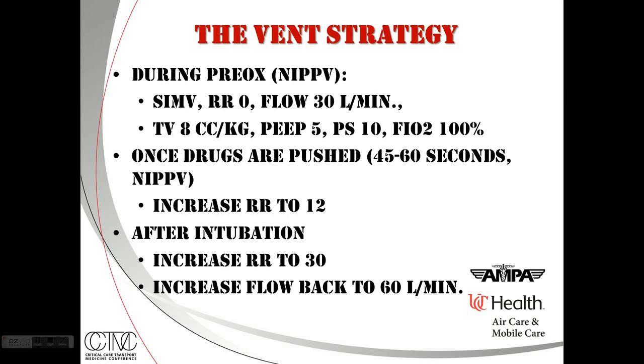It's going to be low, and that's essentially good, and we want to keep it low. We don't want to let that end-tidal increase at all, because if that end-tidal is increasing, in all likelihood that pH is dropping. And so we just want to keep that end-tidal low where it is until we can get ourselves a blood gas and find out exactly where we really are on the pH.